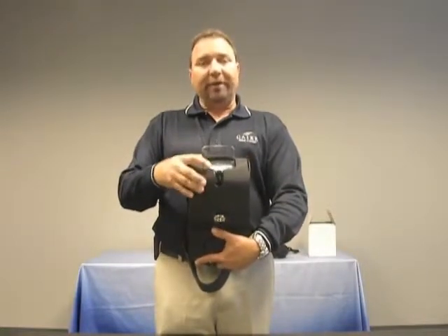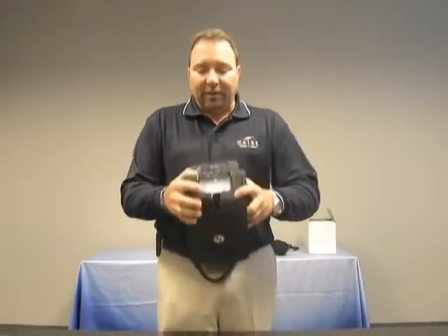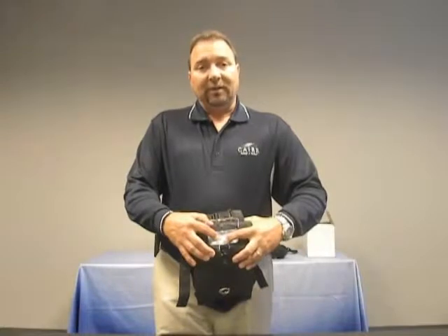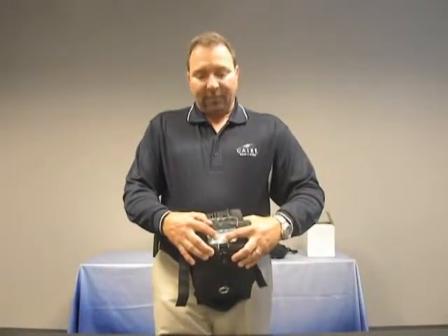Once the portable concentrator has begun to operate, you can then depress buttons 1 and 5 simultaneously until you hear an alarm.